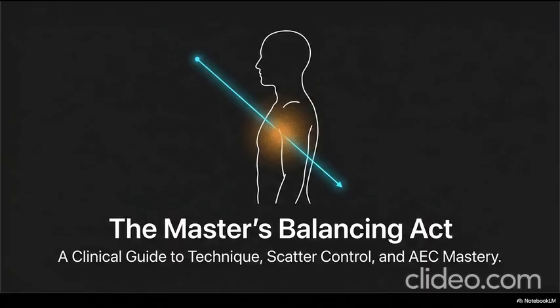Factor of 6. Wait, really? Yeah. That means to get the exact same image brightness with that 16:1 grid, you have to hit the patient with 6 times the amount of radiation you would have used without it. Yes. 6 times the dose. Which is why radiographers must be incredibly precise. Grids are profoundly unforgiving tools.